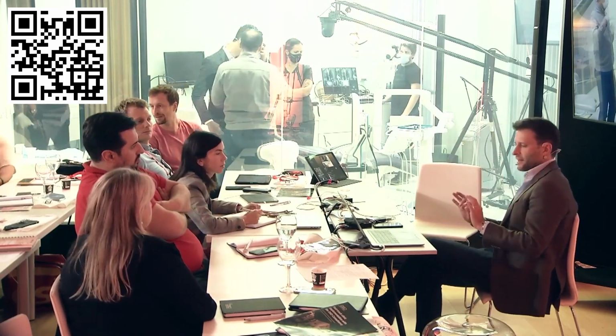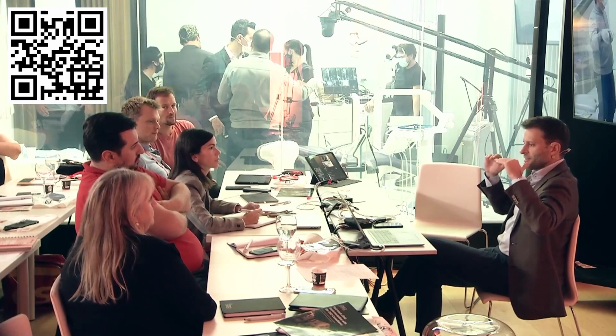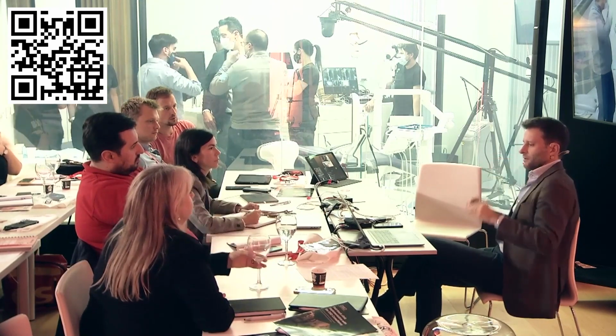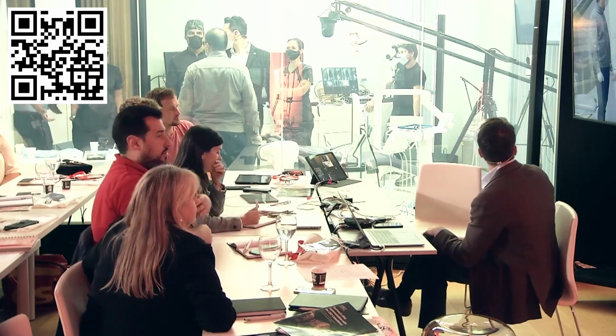If you screw one and the bridge is distorted, you're going to see that it's going to move from the others. So that's what they call the classic passivity test. This is exactly what they're doing.